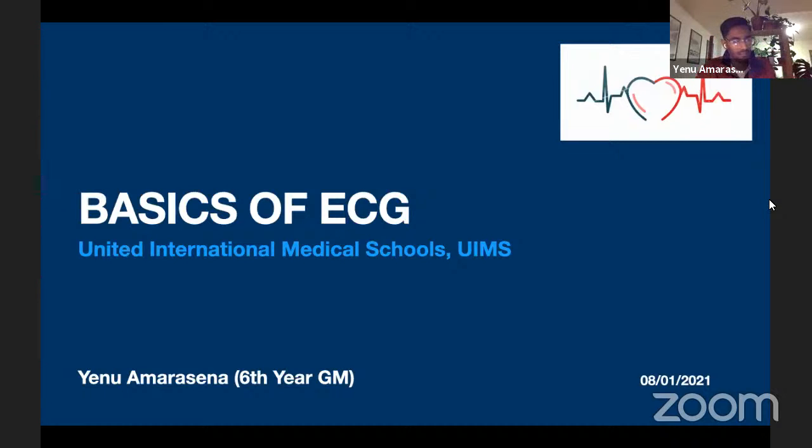ECG is something that I personally had a lot of trouble trying to understand in my first few years of uni and even coming to my clinical years. And it only got better after I found myself to work with a structured system in breaking down ECGs. So I'd like to teach you that, and if it's useful for you guys, I hope you can also use it.